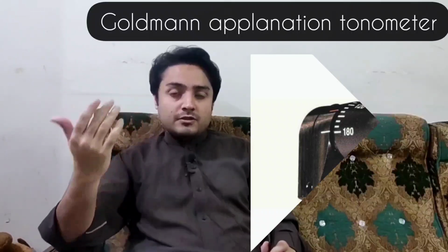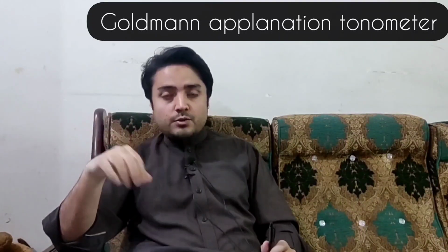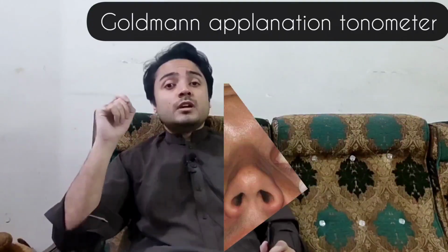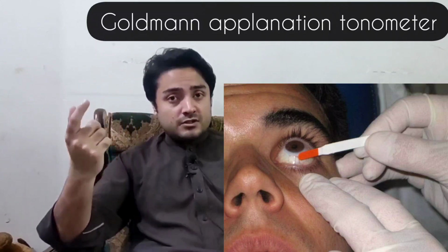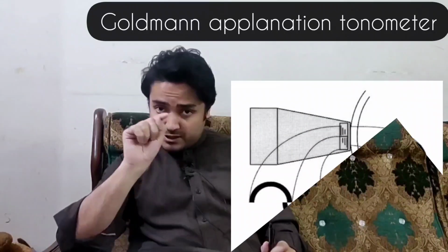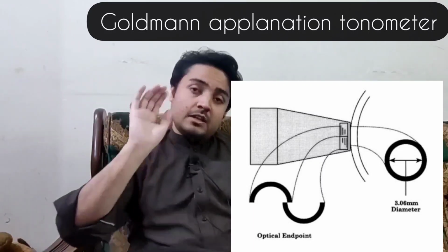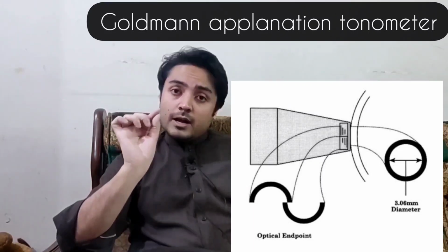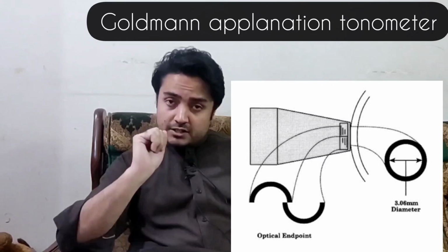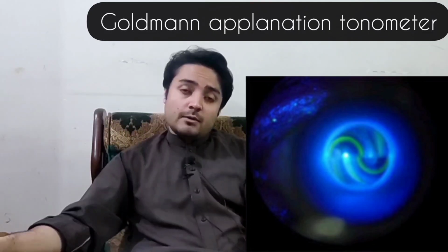So first of all, you have to instill local anesthetic drops in the patient's eye so he doesn't feel pain. Then you stain the eye with a fluorescein strip. Once the eye is stained, you use the cobalt blue filter, and you bring the biprism, which has these mires, towards the center of the cornea, and you applanate the cornea. Once you touch the cornea, you will see these mires in your slit lamp, and they will be stained because you have already stained the eyeball.